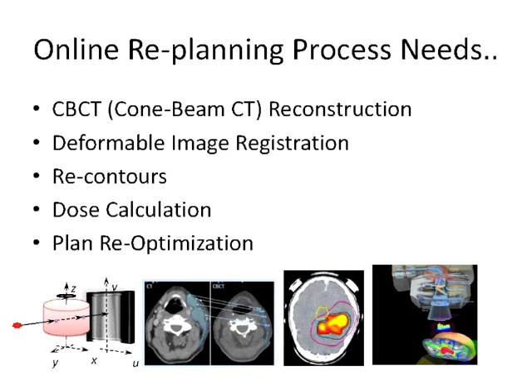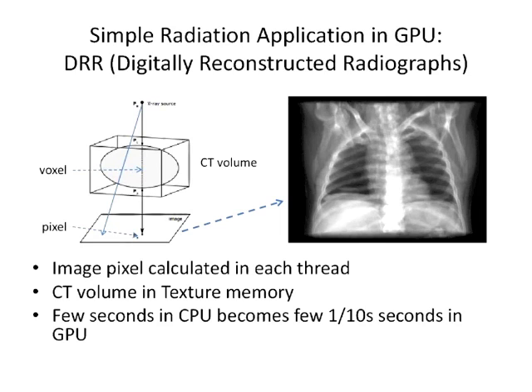How do you do? I mean, presumably, as the beam passes through different kinds of tissues, the scattering will be different. And so, how do you do the SIMD stuff if it's sometimes going through bone and sometimes going through tissue and whatever? Yeah, the scattering was not considered.